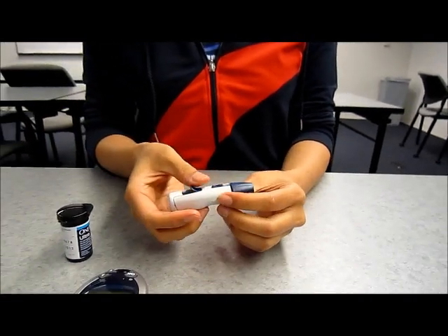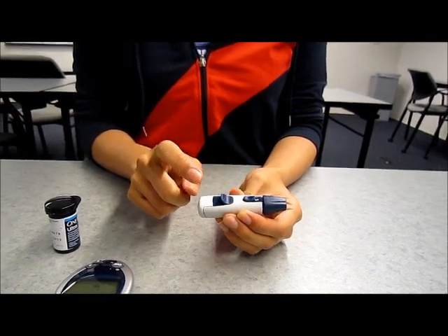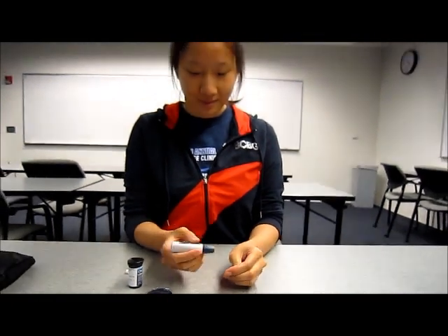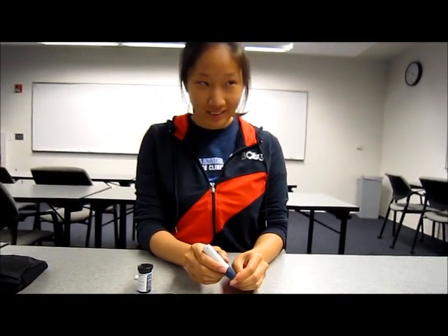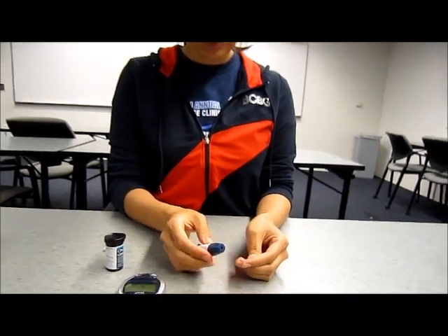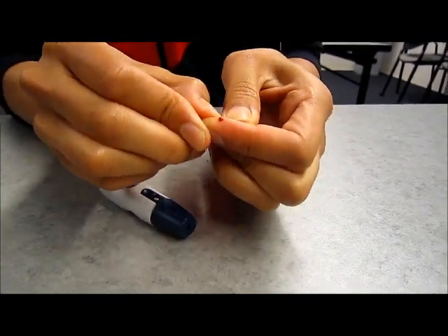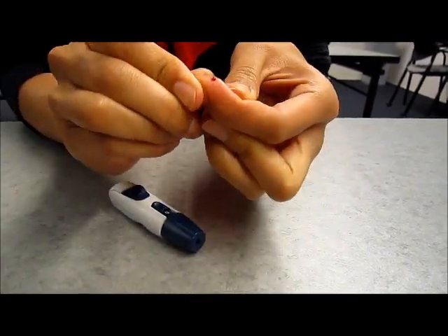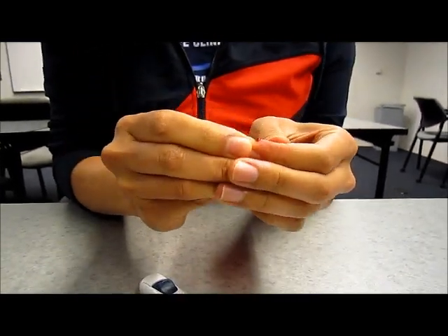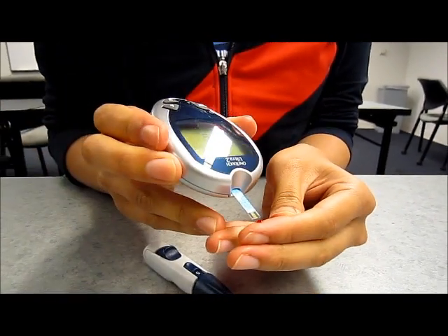Pull the trigger on the device back. Choose a spot on the side of your fingertip and poke it with the lancet device by pressing the button. Wait for a drop of blood to form, then place the drop of blood on or near the testing area. Wait until the right amount of blood has been drawn into the test strip. Your blood sugar levels will appear in about 5 seconds after applying the drop of blood.